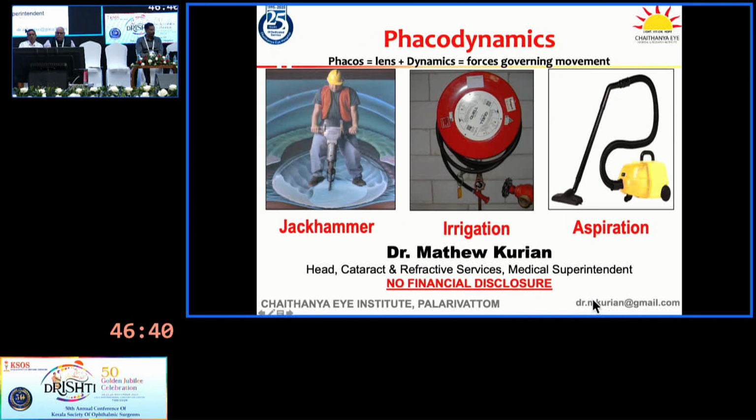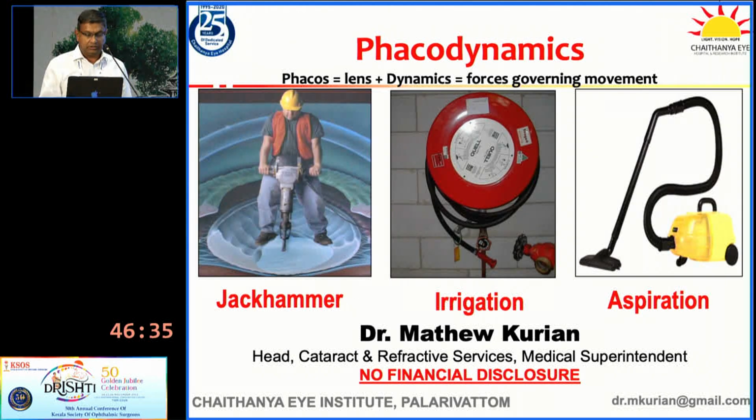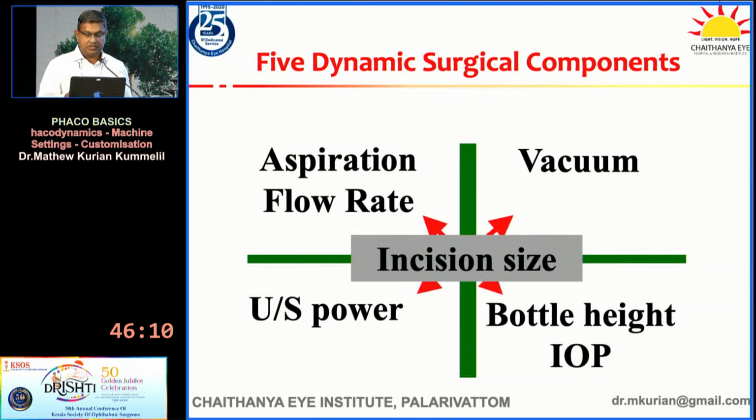Thank you, Arup. So Phaco dynamics is understanding the machine, and the forces that act on the nucleus through the machine are the jackhammer of the Phaco emulsification, irrigation, and aspiration. I have no financial interest for this presentation. So there are 5 dynamic surgical components: aspiration flow rate, vacuum and bottle height, and the ultrasound power. All put together work, and the incision size is what actually keeps these things in certain critical limits.